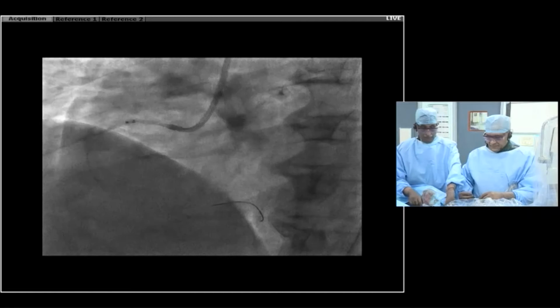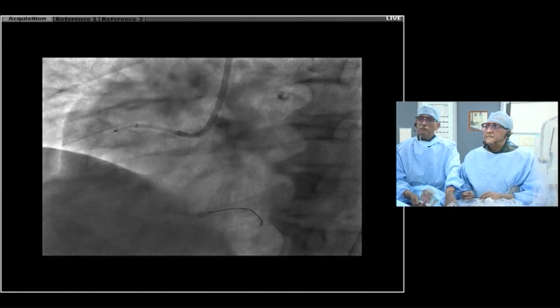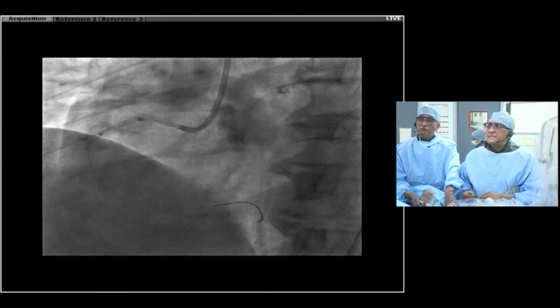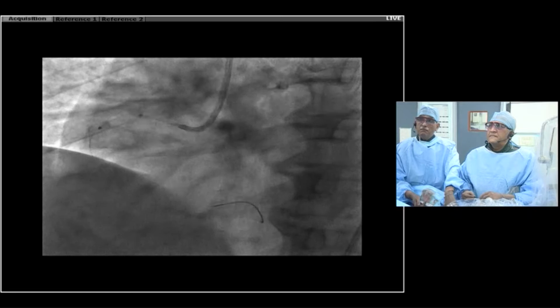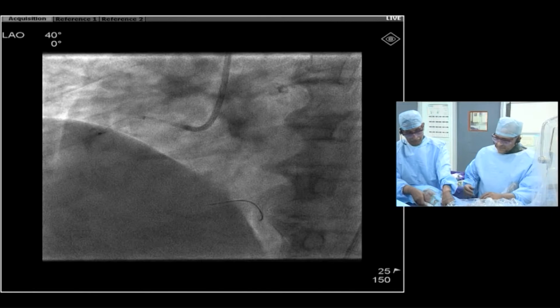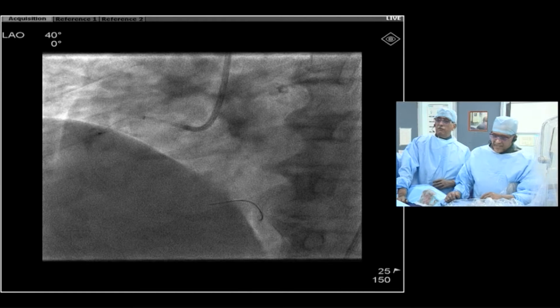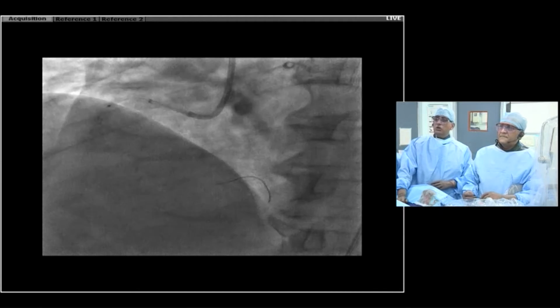Okay, let's go. Clear. And you have to be careful. You're watching the STs. You want to make sure that there's no cavitation and embolization that way. If that happens, then you need to give it a rest. So those are the things to watch with laser.